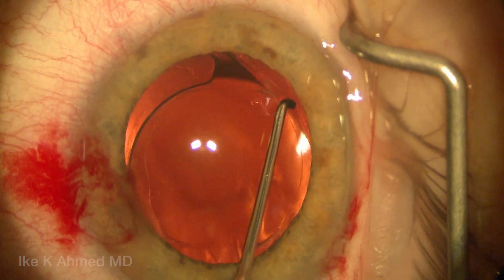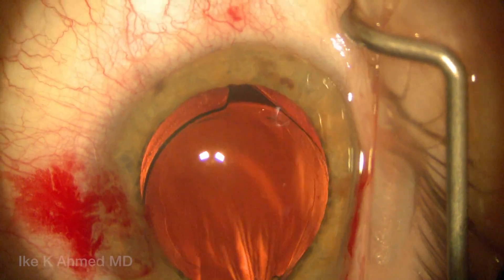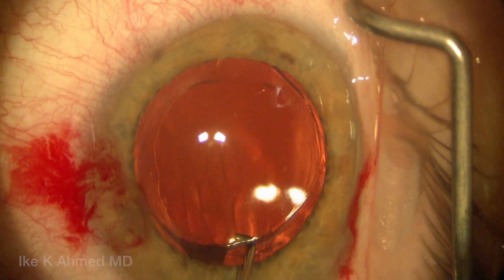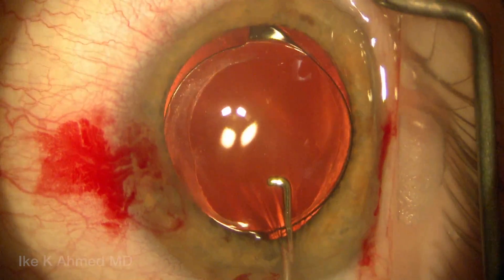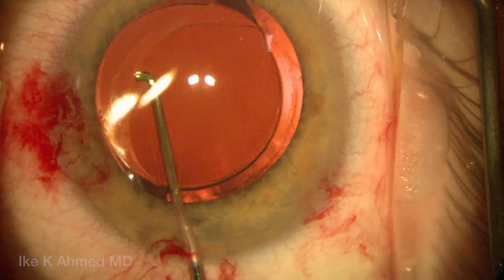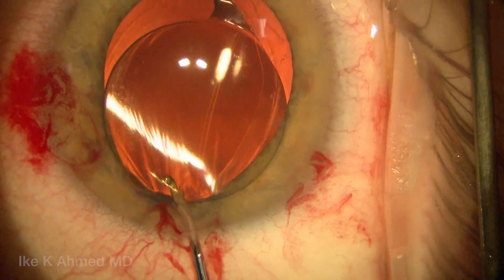You can see pushing down the optic helps place it away from the capsular edge, and essentially then using the Sinskey to manually separate. Now the Sinskey is behind the optic, placing and pushing the optic forward through the anterior capsular opening.